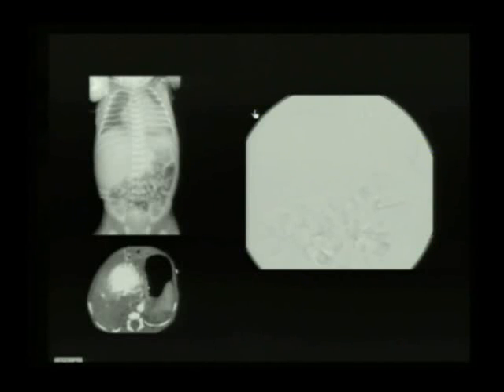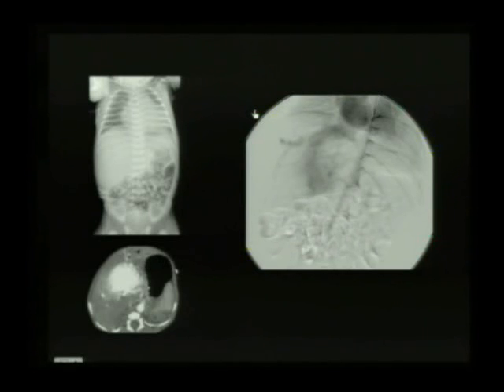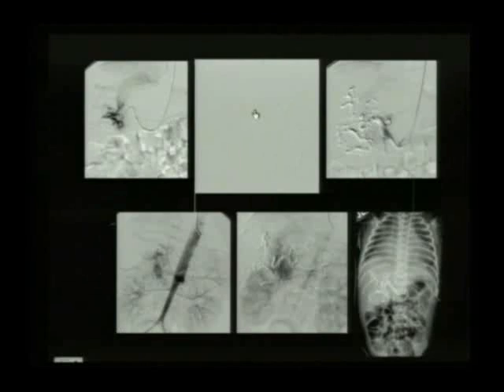And you wouldn't put these babies through diagnostic angiography unless you were prepared to do the embolization at the same sitting. And here is the angiogram on this baby, similar to the last neonate. Actually, both these babies with hepatic AVMs weighed 2.7 and 2.8 kilograms. They were slightly premature. So there's rapid shunting, and the decision is really, well, we've got to do something about this. So we decided on both these babies, and I don't know why, but they appeared within 6 weeks of each other for us to embolize.